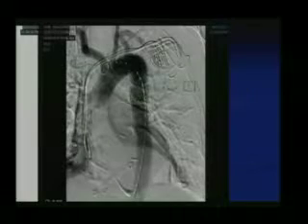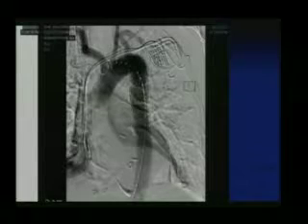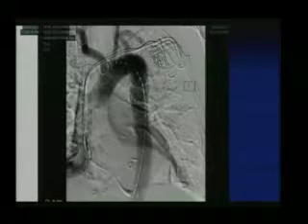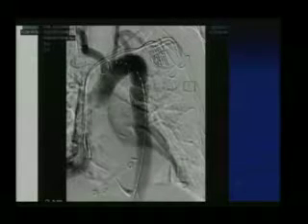Type 2, you can do coil embolization of the IMA, intercostal, but it's extremely difficult. Sometimes, for an aneurysmal case, most of the type 2, I would say, resolve on the following CT scans, because during the case the patient is heparinized, fully anticoagulated, so you'll see some endoleak, but most of the time type 2 endoleak resolves. The only time you intervene is when the sac is increasing, the aneurysm size is increasing, and the patient is symptomatic.